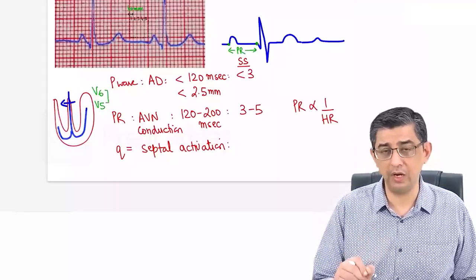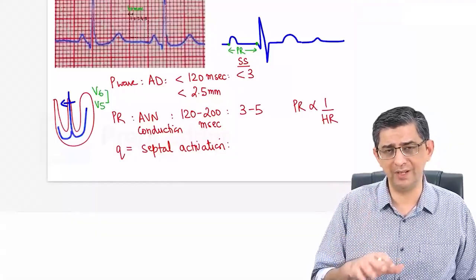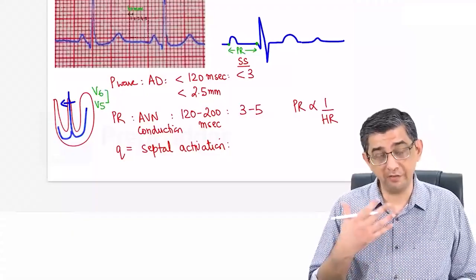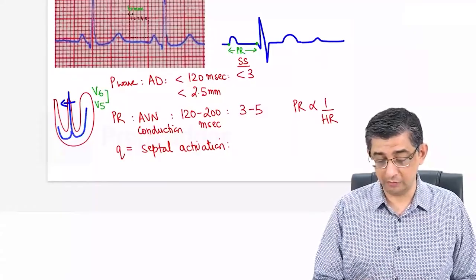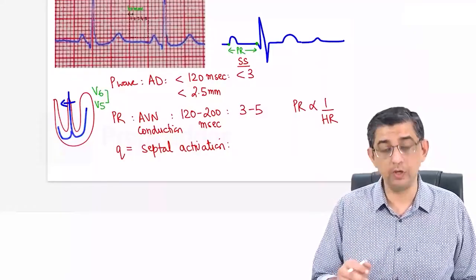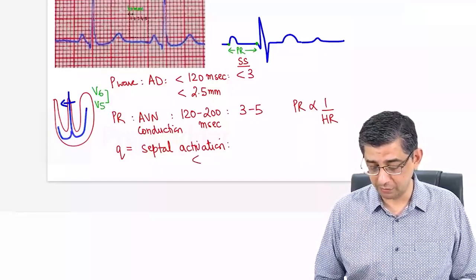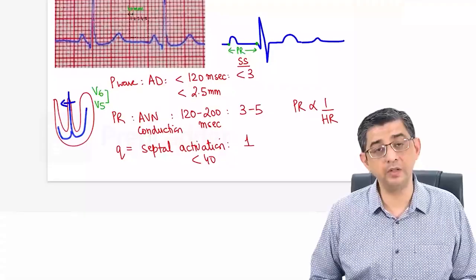I mean, it's futile on your part to look and check out the Q waves in V1, V2 where they're hardly seen. It is mainly V5, V6 where they are seen, and we'll definitely talk about conditions where we get capital Q waves as well. Now, if they ask you what is the duration of a normal Q wave, then your answer would be that this would be less than 40 milliseconds, and therefore it will fit into one small square in the ECG.